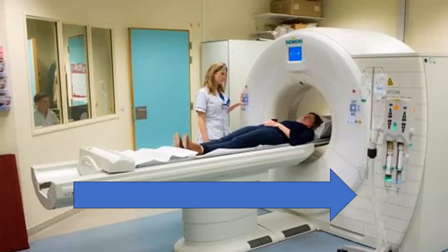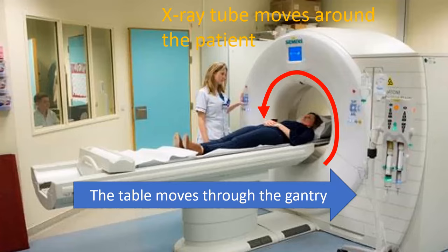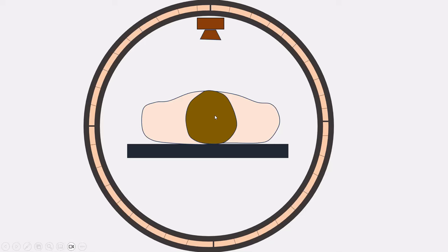What is a CT exactly? Well, this is a CT machine. It's one of the CT machines we have at our hospital. And as you see, there's a table and the patient is positioned on the table, and there's a huge tube here, the so-called gantry. The table moves through the gantry, and while the table moves through the gantry, there's an X-ray tube moving around the patient in the gantry, emitting X-rays. And that is basically how a CT machine works.